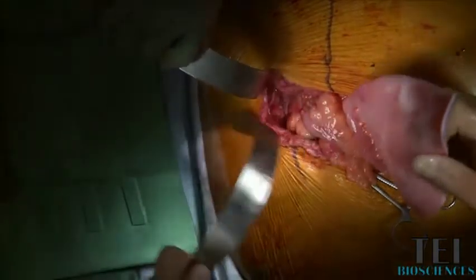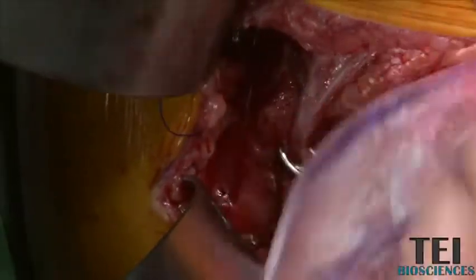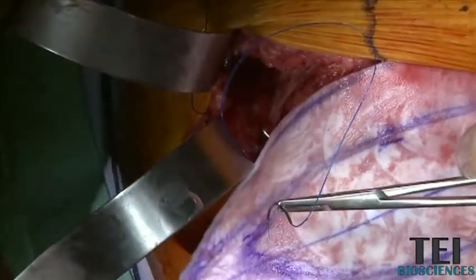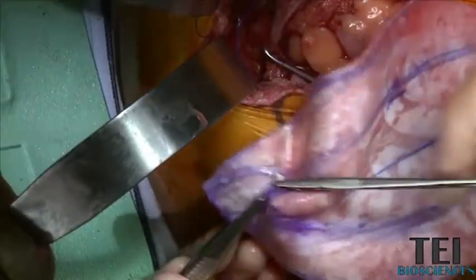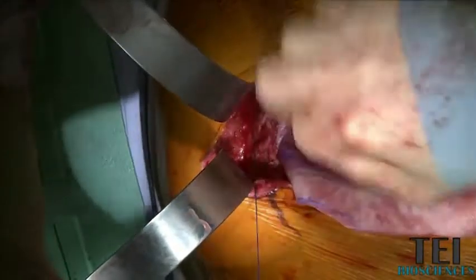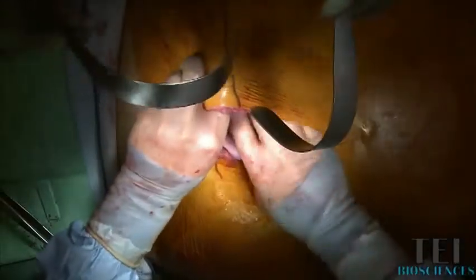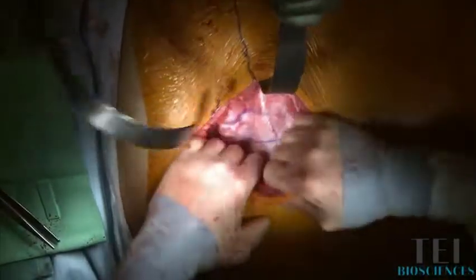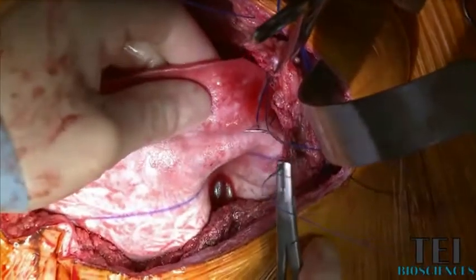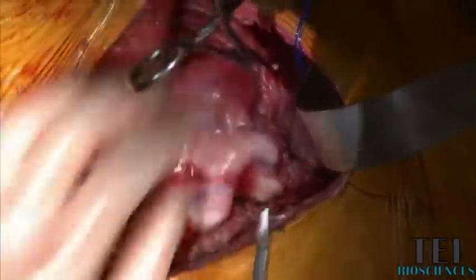Now we'll set the toe and get these in here. Through the fascia, take the heavy forceps in and out of the material and you kind of dolphin it through. At this point we can lay the bioprosthetic under here and see how this whole thing is going to set up. I always put my hand back behind this mesh as I place this through because I don't want to get any bowel in the way.